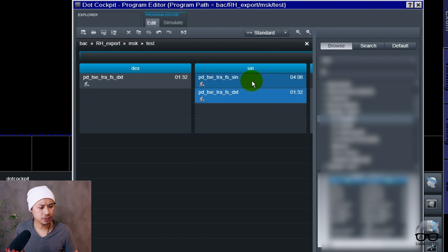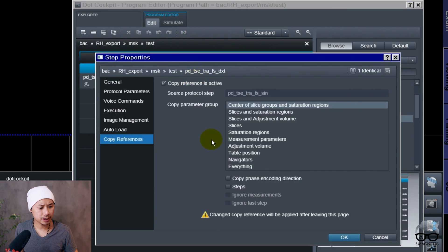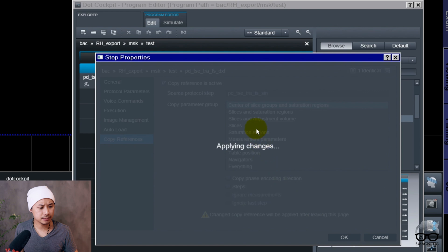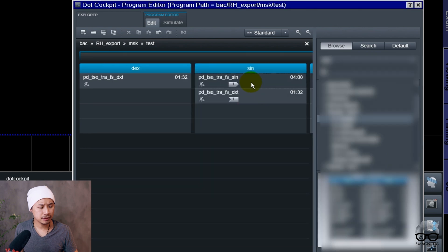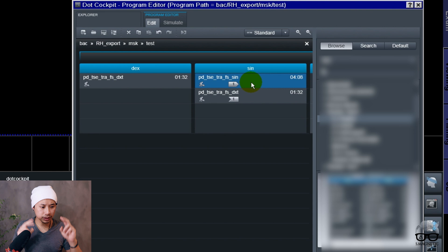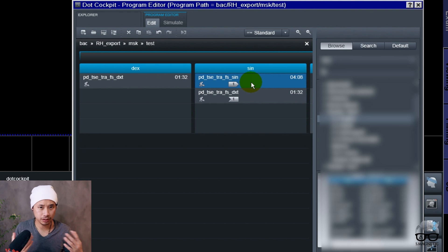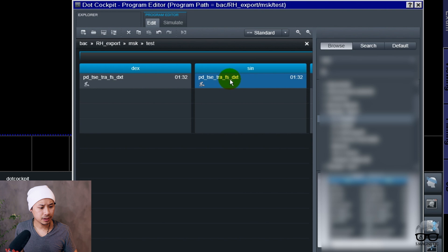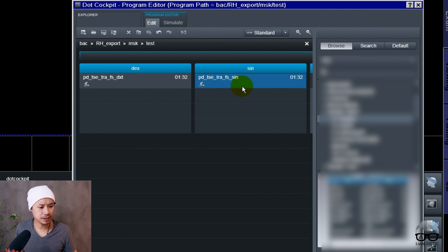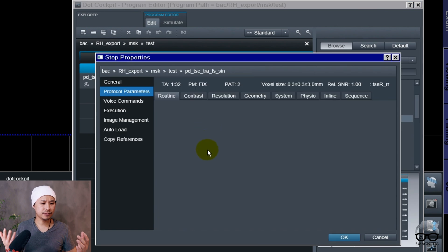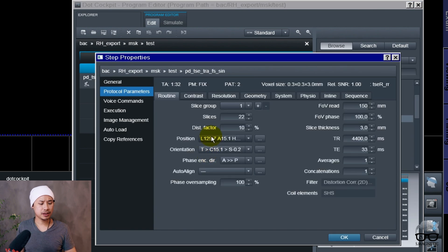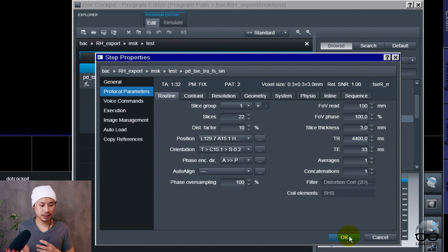Now all I've got to do is copy these two, create copy reference center, then I can delete the old PD fat sat which took longer.